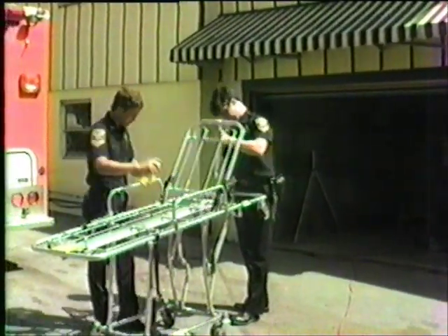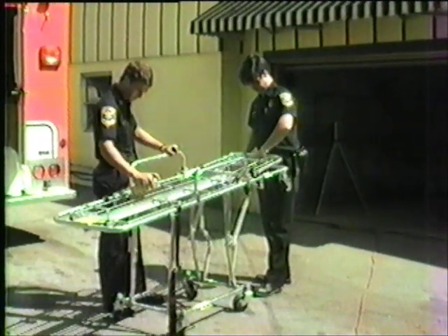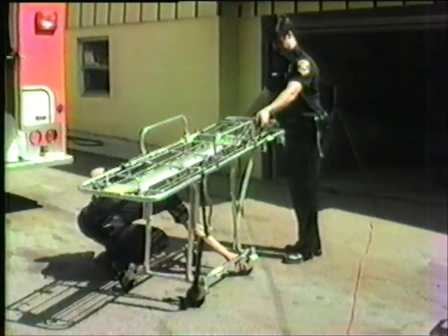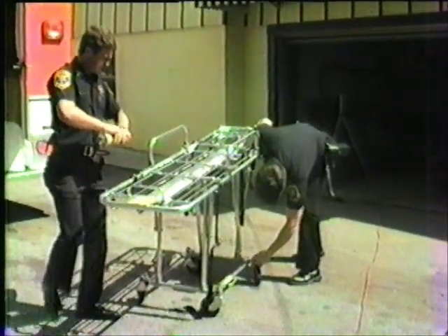Proper preventive maintenance should be performed daily on your stretcher. Make sure the stretcher is clean. Keep the stretcher lubricated. Check all stretcher functions including into the vehicle, out of the vehicle, all stretcher heights, wheel casters, and loose bolts or Allen screws. Avoid embarrassing or hazardous situations.